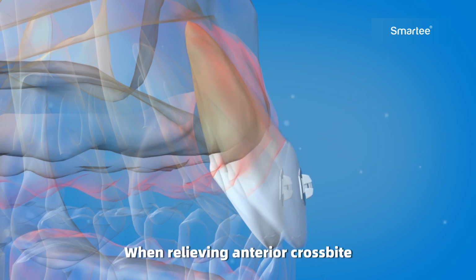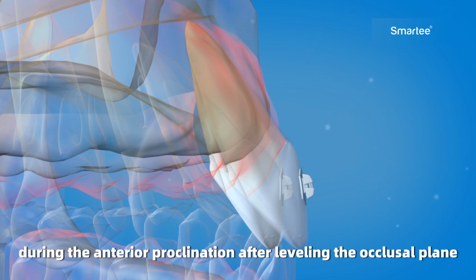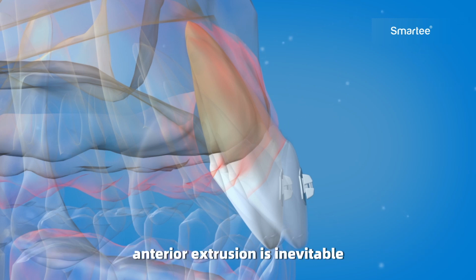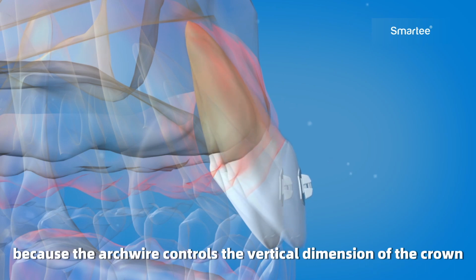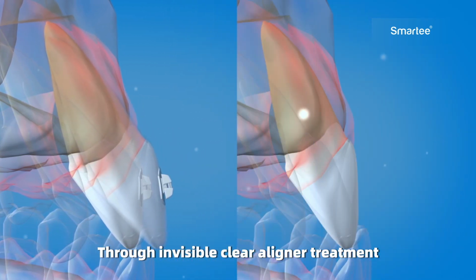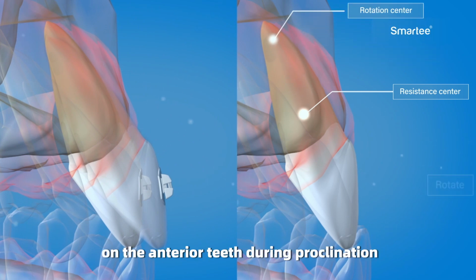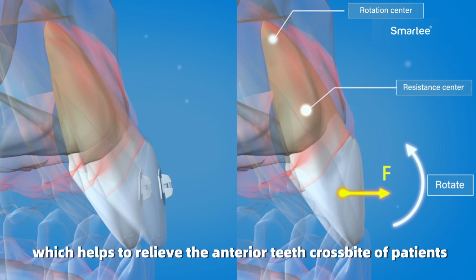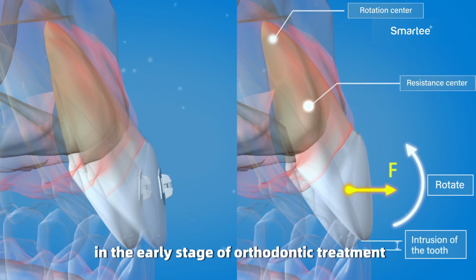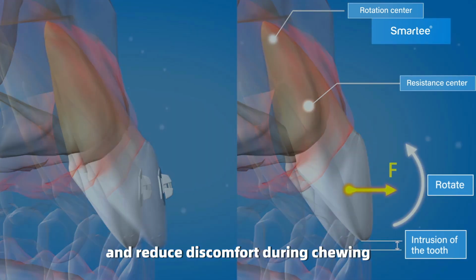When relieving anterior crossbite using traditional fixed orthodontics, during the anterior proclination after leveling the occlusal plane, anterior extrusion is inevitable because the arch wire controls the vertical dimension of the crown. Through invisible clear aligner treatment, there is a significant relative intrusion on the anterior teeth during proclination, which helps to relieve the anterior teeth crossbite of patients in the early stage of orthodontic treatment, to avoid occlusal trauma and reduce discomfort during chewing.